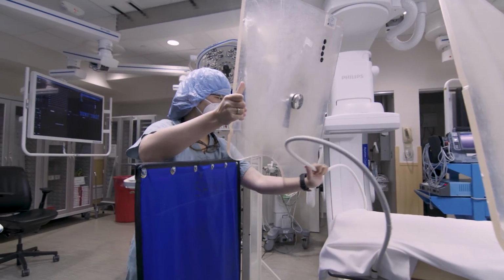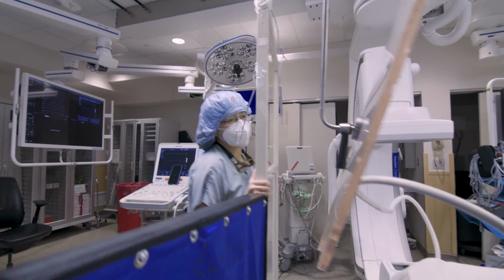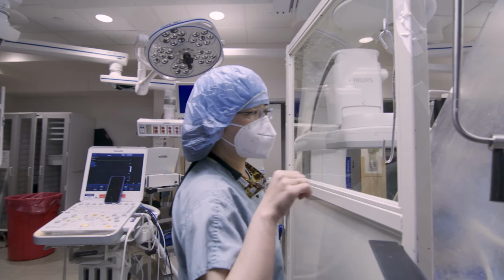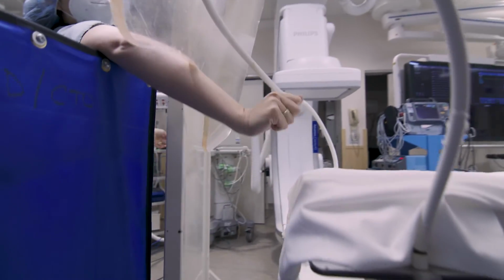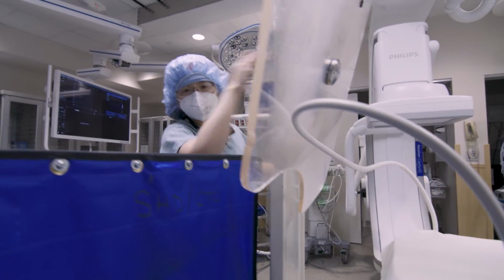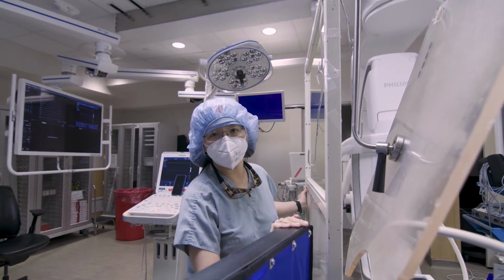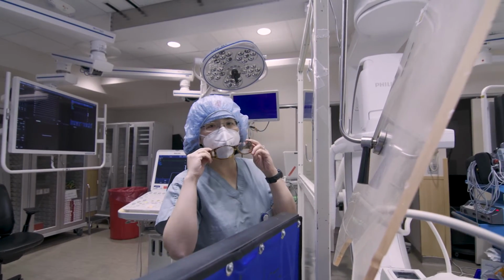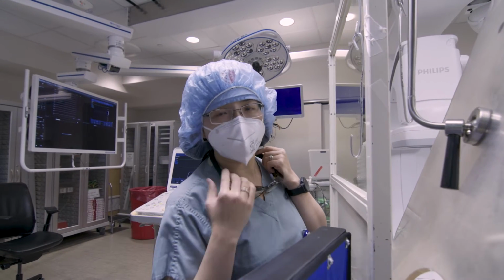What we additionally have is that when we're standing at the head of the bed, when these shields are put into place, we have a 7-foot shield that I can additionally stand behind. So from my perspective, I can put my arm out and do my imaging, and only my right hand is going to be exposed when I'm doing any imaging. But my brain, my eyes, my organs are all protected with this comprehensive shielding. And my radiation protection is very, very good. And on top of that, I have a lead cap. I have my radiation protection lead glasses. And then I have my leads, which I'm not wearing right now, that are double leaded.